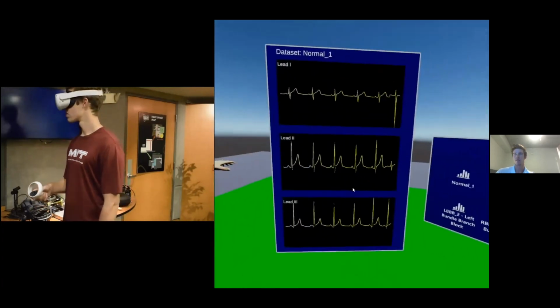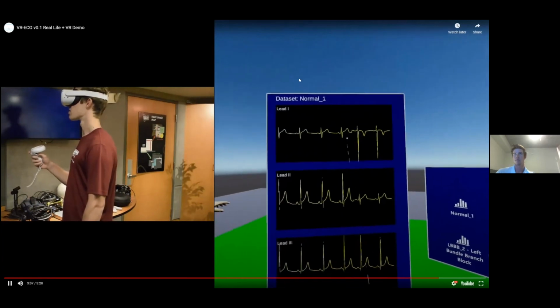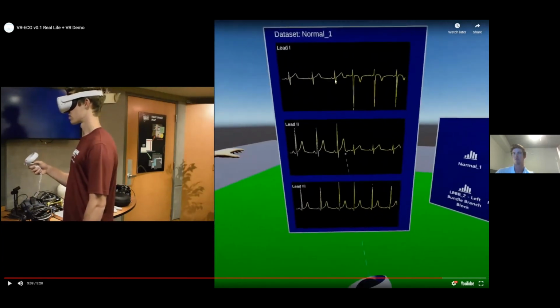As you can see, if I pause it right about here in the middle, the left side of the graph is before moving that lead, and the right side is after moving that lead. Since I moved one lead, one sticky, that would affect two of the vectors, and one of the vectors would stay the same.